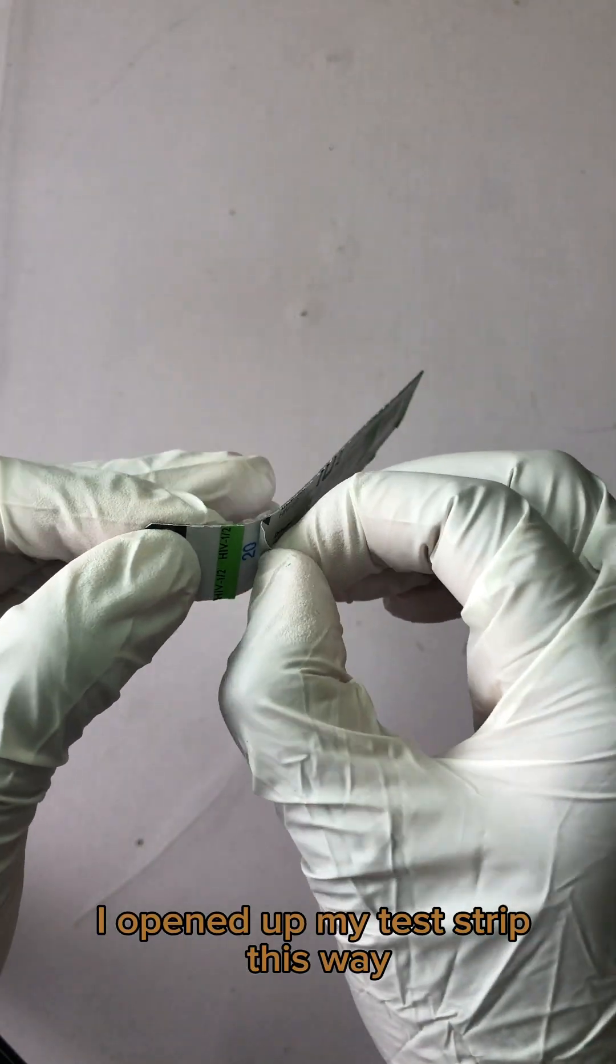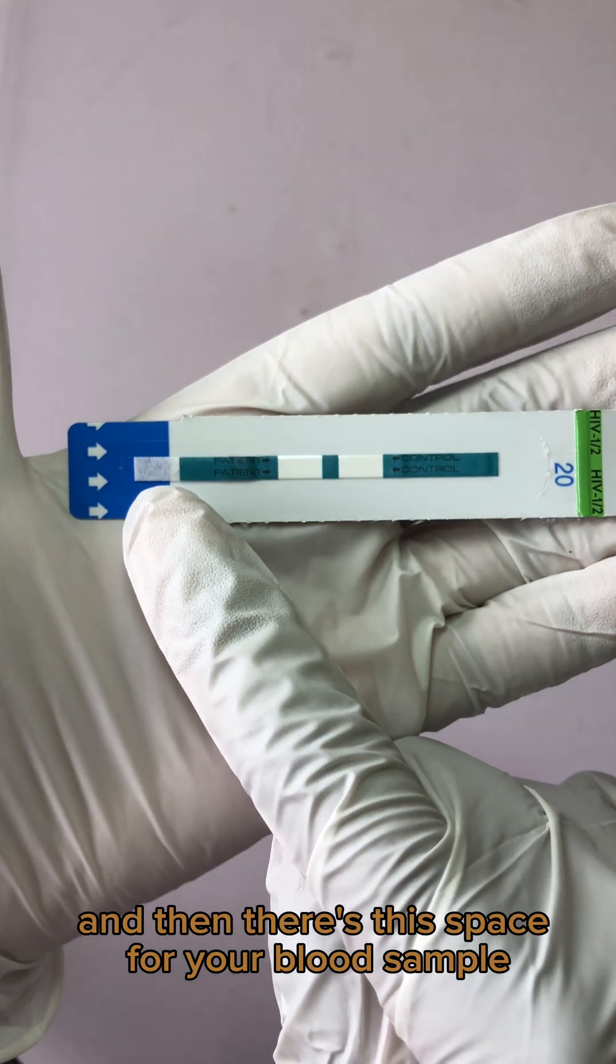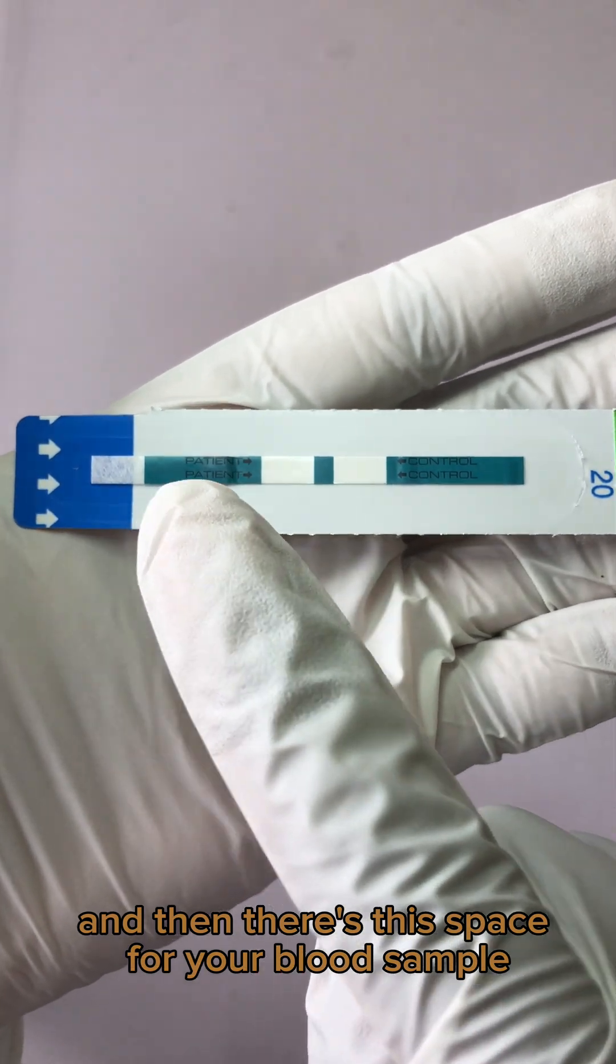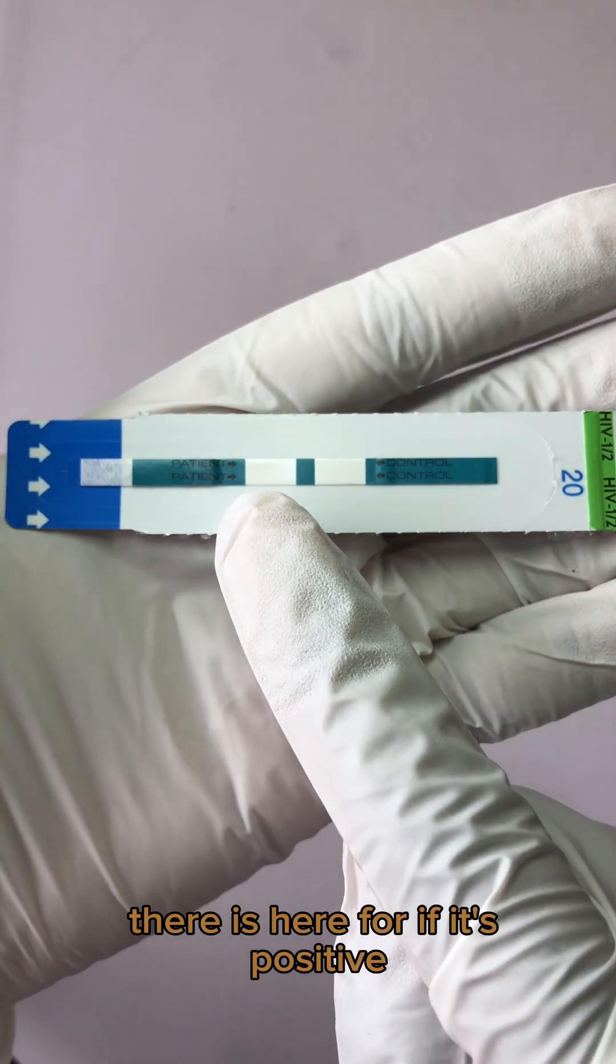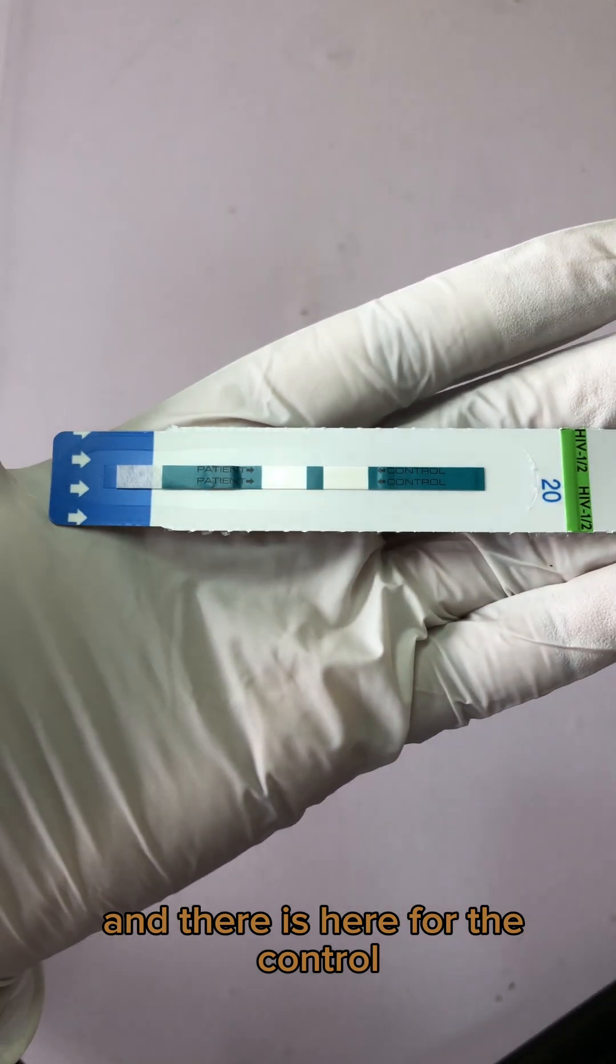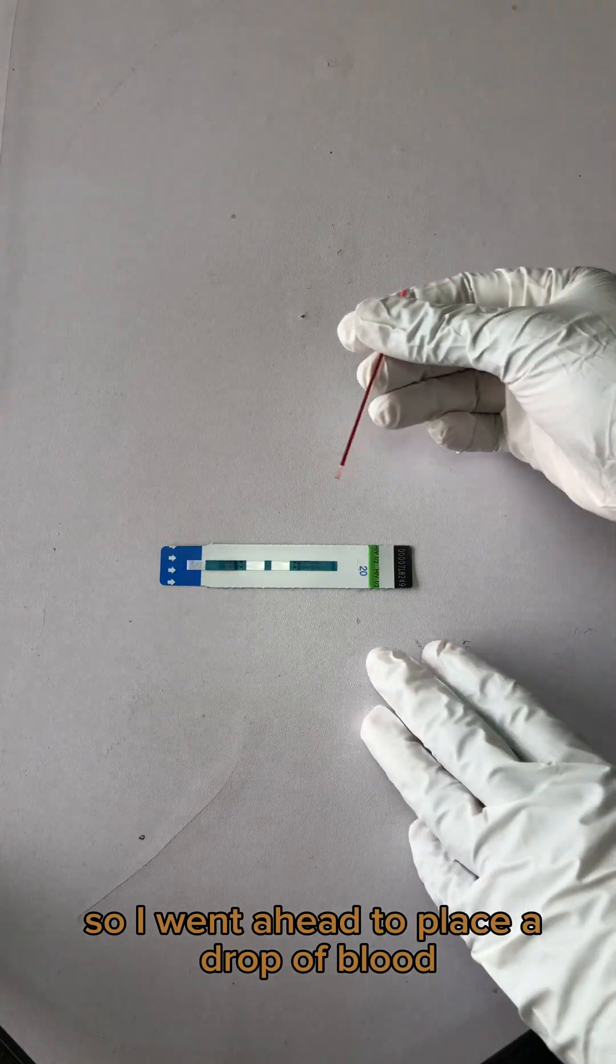I open my test strip this way. There is this space for your blood sample, there is here for if it's positive, and there is here for the control. So I went ahead to place a drop of blood in the space created for the blood sample.